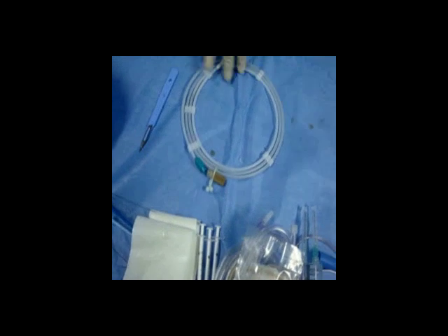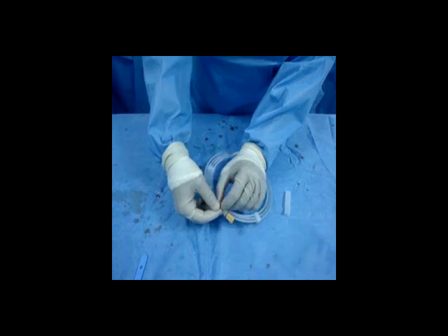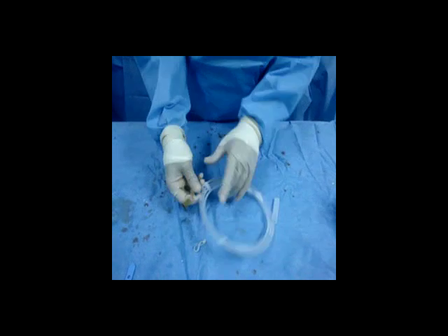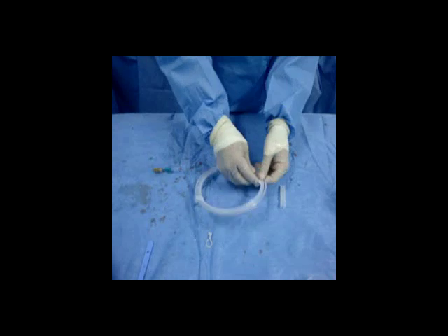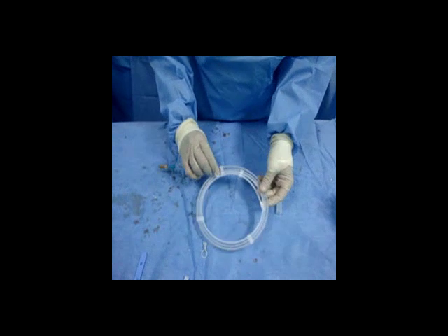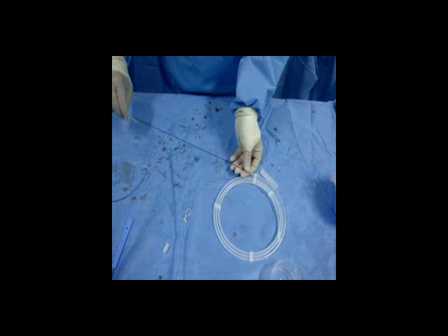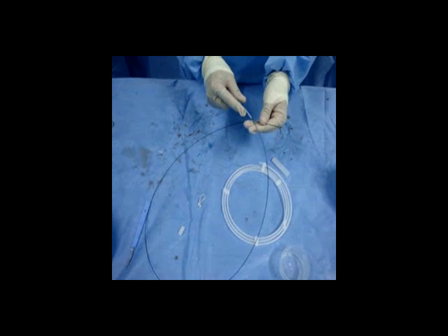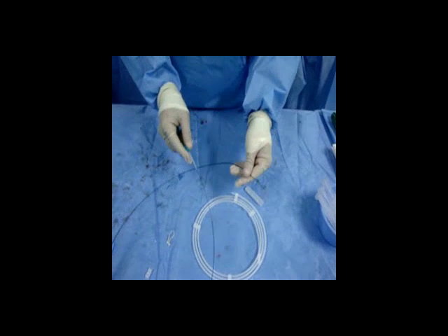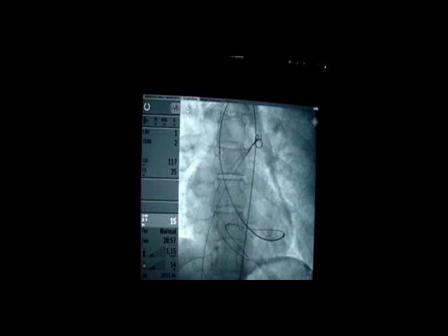Now, what we will do is use the snare. That is the snare here, which we will use to snare the wire from the main pulmonary artery. We'll show it to you in a minute as we cross to the main pulmonary artery and get it snapped. That's how it actually looks like — the snare was opened and then it was pulled.